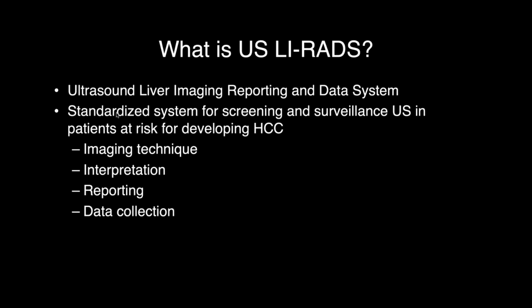So ultrasound LI-RADS stands for Ultrasound Liver Imaging Reporting and Data System. And we provide a standardized system for screening and surveillance ultrasounds in patients who are at risk for developing hepatocellular carcinoma. All major hepatology societies actually recommend using ultrasound for screening and surveillance. But interestingly, many of these societies do not provide any guidance as to how to perform the ultrasound, how to interpret the examination, or how to report the findings. So there is a huge void in the management guidelines out there, and we help to fill this void. And with standardization, the goal is to improve our ability to collect data, which can then hopefully help inform future potential changes.